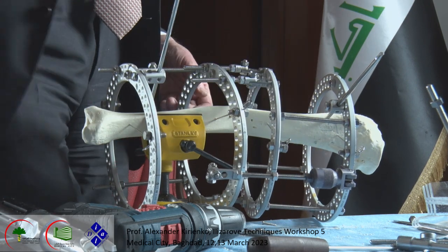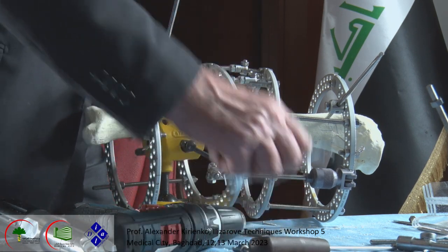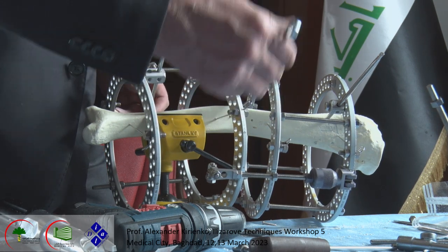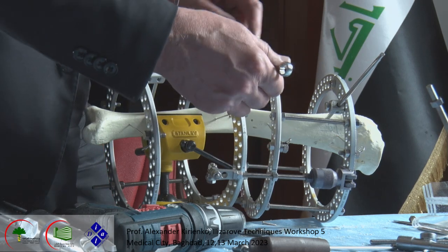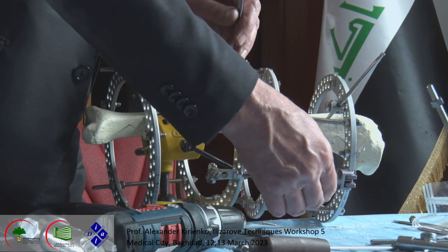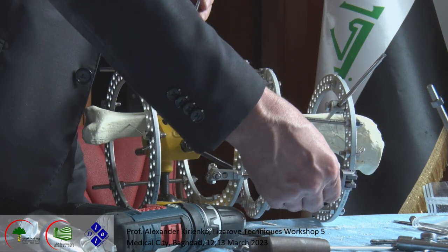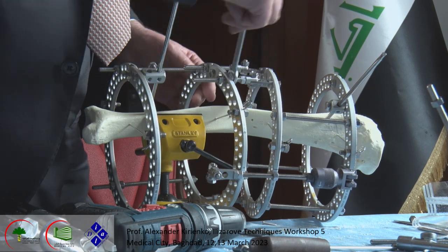For this reason, we use a motor because of the big deformity. And what we do here, we do distraction. You see, it is the same function. I do correction here, and simultaneously I do the motor. But if I don't use the motor, I might do it only with this system, like this.